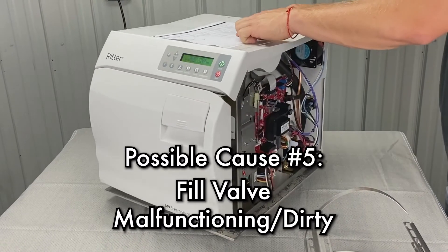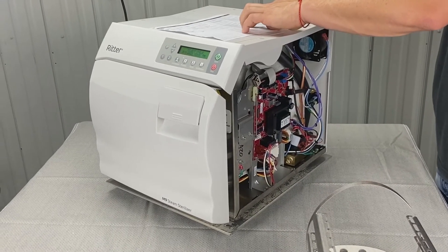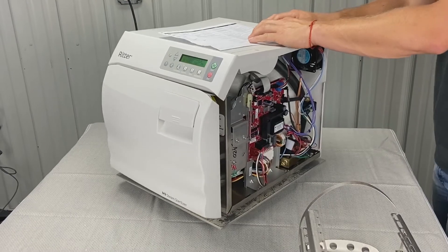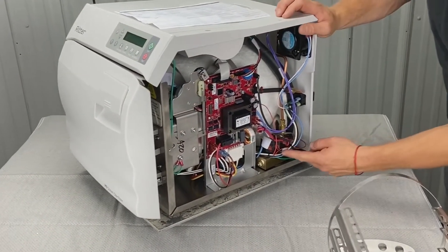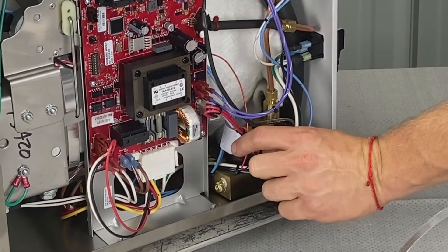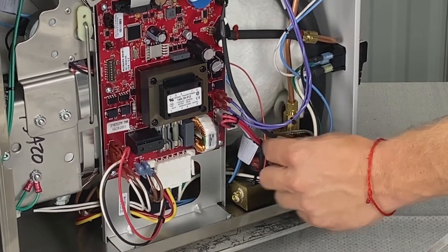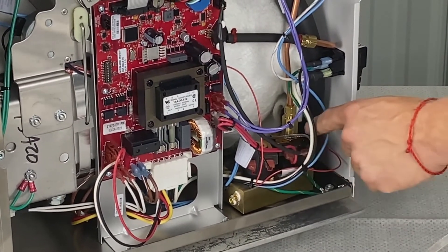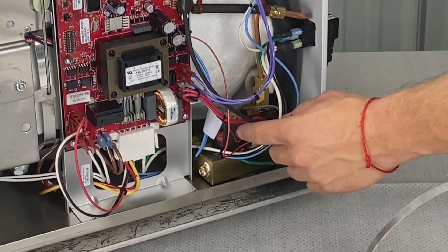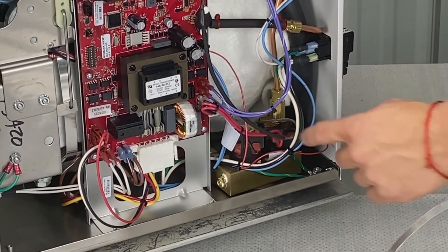Fill valve malfunctioning or dirty. Inspect the fill valve related tubing for restrictions. Clean and replace the fill valve. Inspect the two wires connecting to the fill valve and PC board for damage or loose connections, and secure or repair as needed. This valve in the front is the fill valve. There are a lot of different versions of the Midmark M11 — some have a rectifier in between the board and the fill valve, and sometimes those go bad. This style has the rectifier built in. You can ohm it out with an ohmmeter to see if it's ohming out, but it could be the coil itself, the plunger inside is stuck, the spring is bad, or the rectifier.